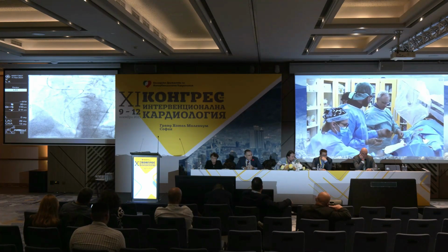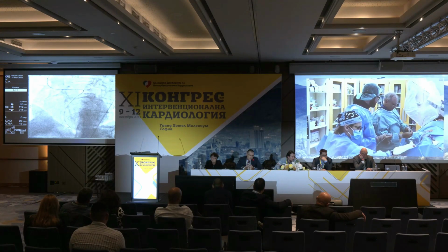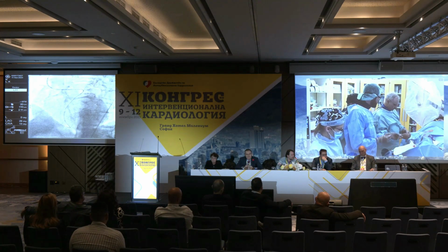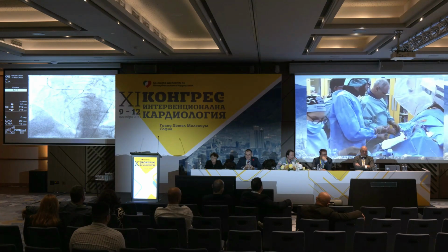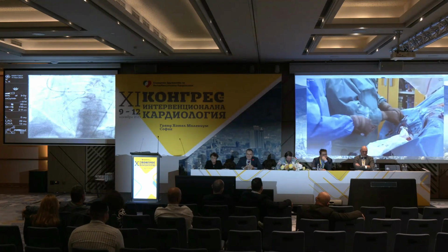To follow the cliche, what kind of stent will you implant? I mean, what company? Science. Okay. We need some advertisement here. This is what I'm asking for. Say the name of the stent. Science. Oh, great. Which type of Science?